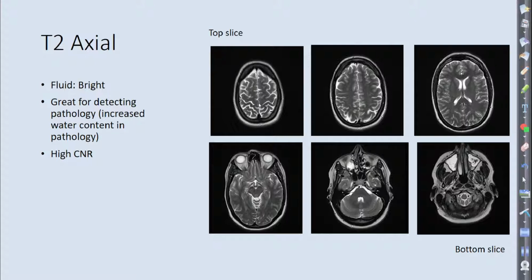You can see within the folds of the brain, you can see the fluid. You can see it within the globes of the eyes, and then within the ventricles and around the spinal cord. You can also see fluid in the sinus cavities. What sinus cavity is this? Maxillary. So this person has some serious sinus issues, right? And don't be frightened by that, because pretty much everybody on the planet has sinuses that look like this. You'll be like, oh my god, they have a tumor in their sinus. No. Everybody has some kind of fluid within their sinuses.